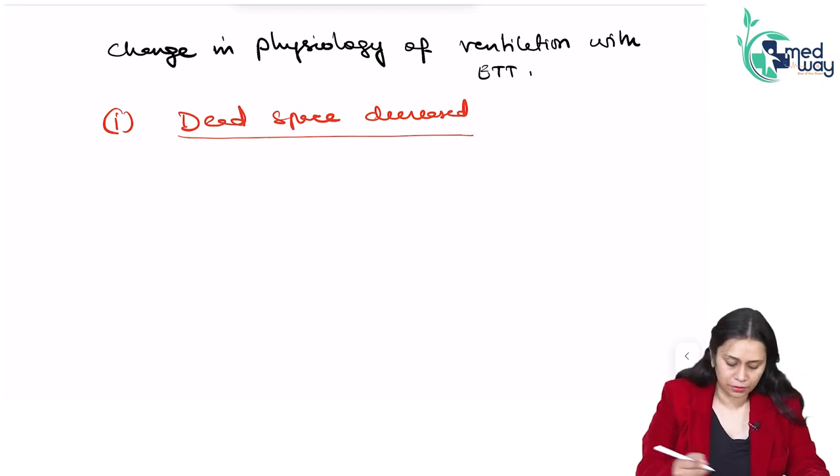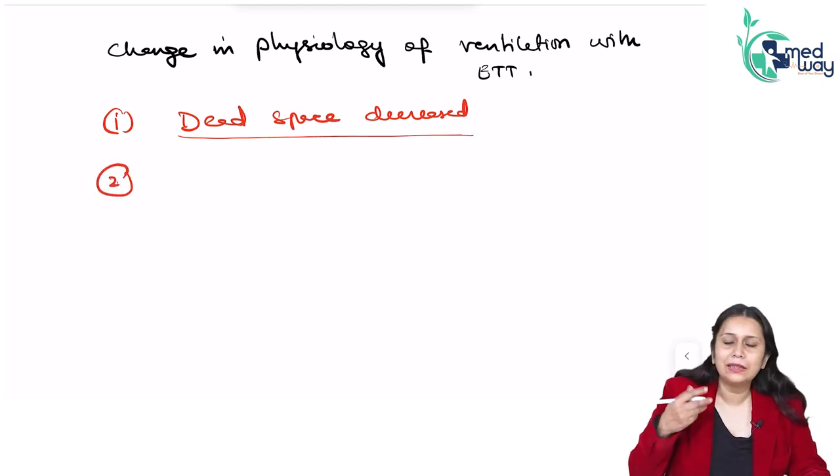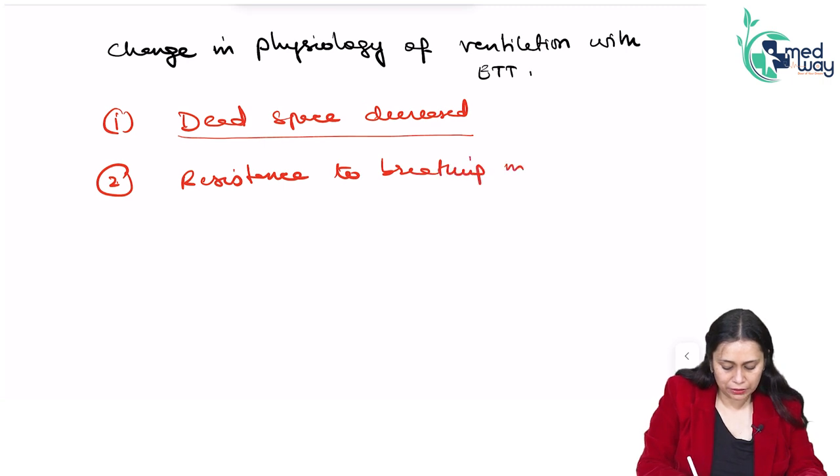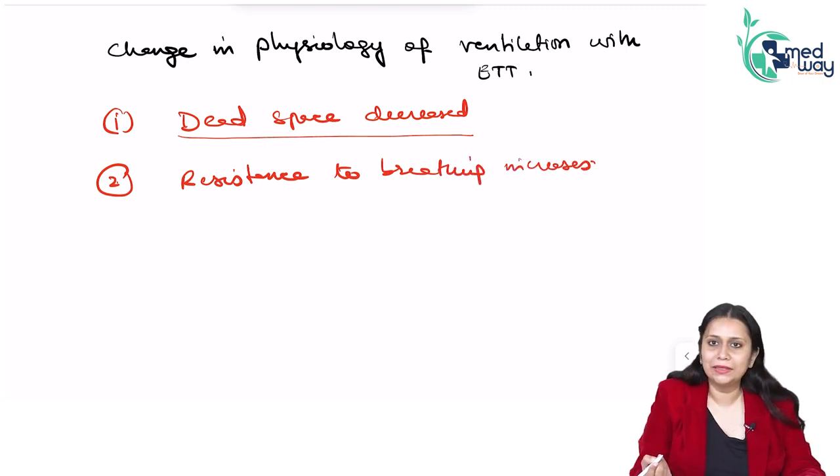This is a benefit. The second is that the resistance to breathing increases. This is a demerit. Why does this happen?